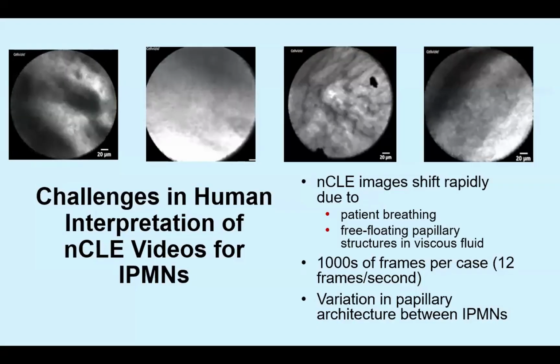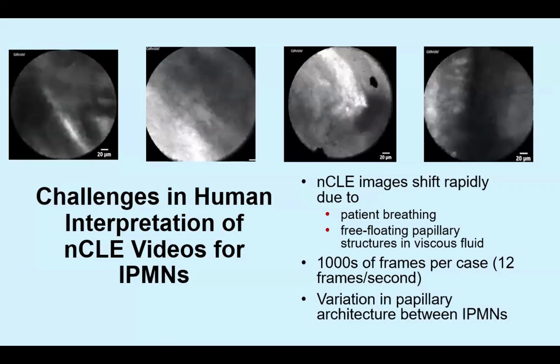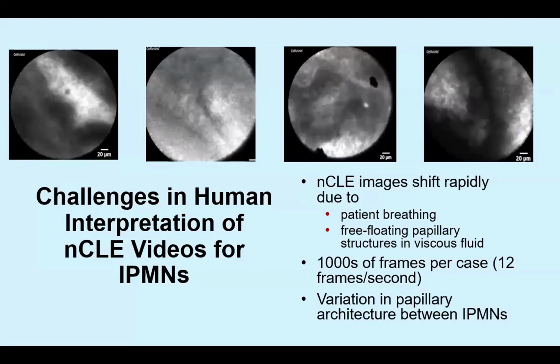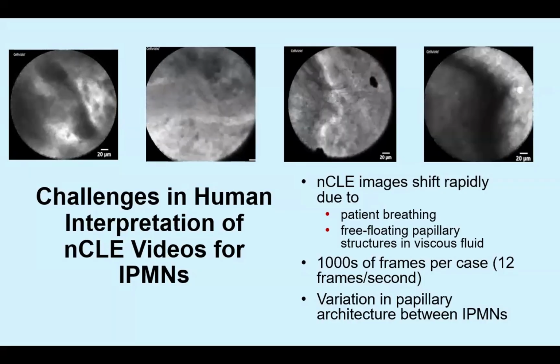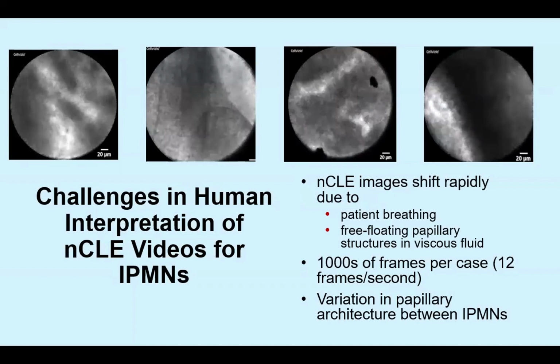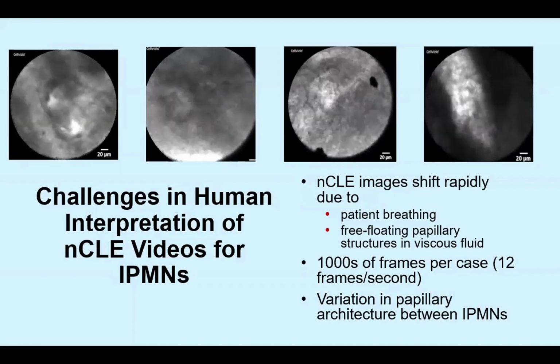So here are multiple endomicroscopy videos. As you start learning endomicroscopy, it gets to be challenging. The patient is breathing, the diaphragm is moving constantly, and these papillae, to complicate matters, are free-floating structures in a fluid media. So for the human eye, till you are trained with enough cases, it gets very challenging to judge the level of dysplasia.